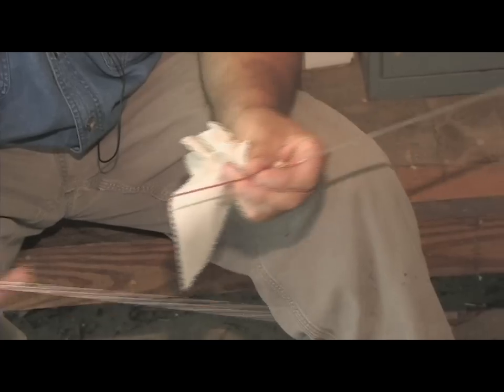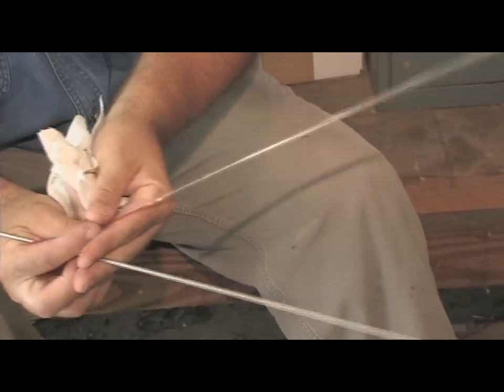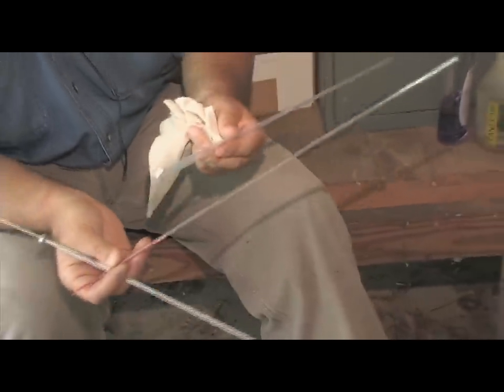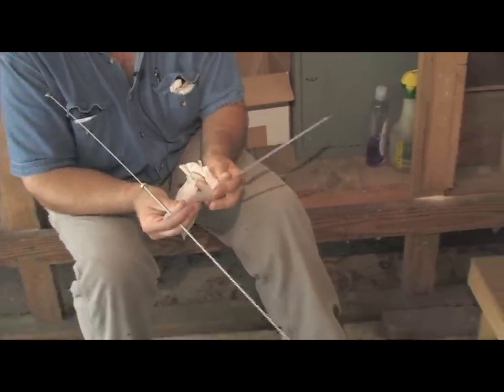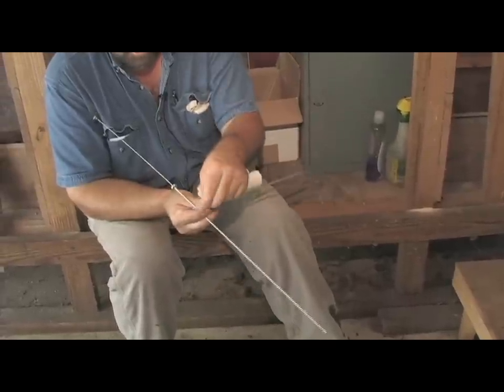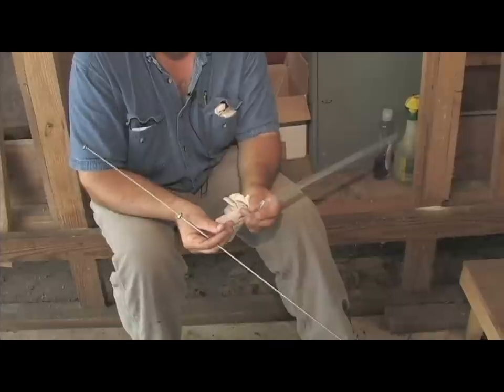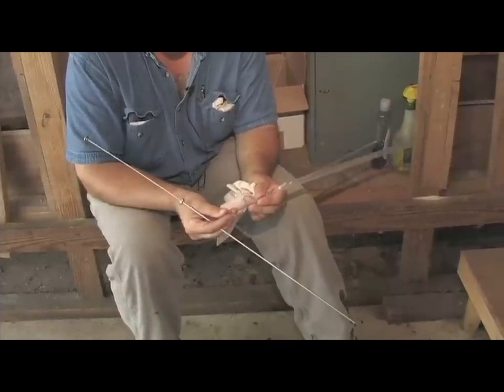I'm going to load it on a new one just to show you what it's like. Here's a new one that I showed you earlier — it's already been contaminated. Sterility is very important for all that you're doing here. You don't want to get a bunch of germs and give the old girl an infection or something like that. So we washed all this equipment with soap and water and alcohol. It's just very important.